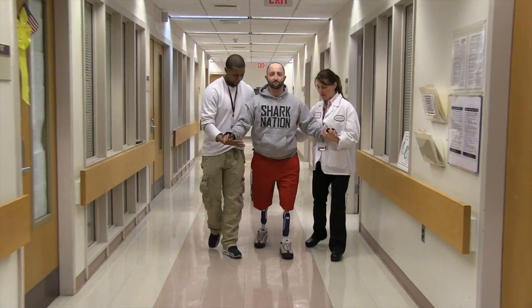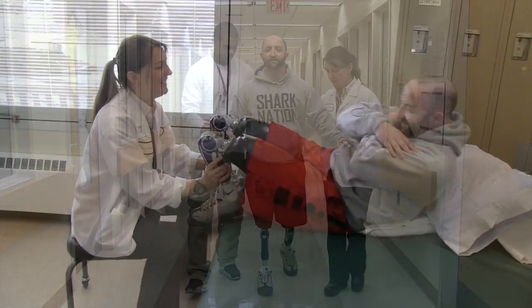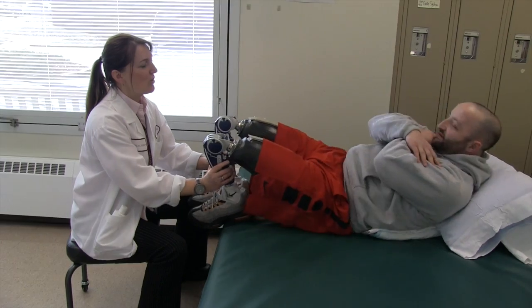Nice. And look around. I don't feel better, and you don't have much weight on me. The legs are... And now go diagonal.